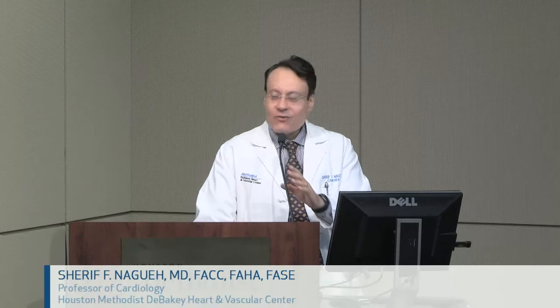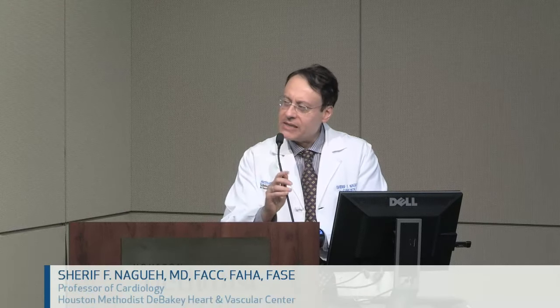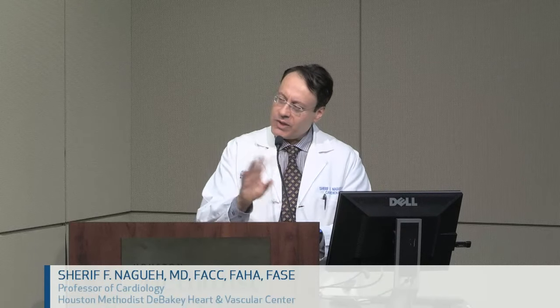Okay, so depends on age and gender. If you are older, we'll hear maybe your RV gets weak. We'll see. For us, neither LV nor RV function are expected to vary with age, nor do indices of systolic function vary with age. It's only indices of diastolic function.